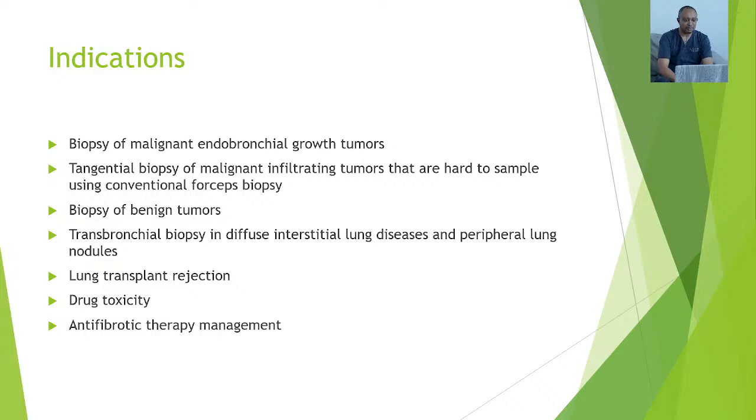When one does the biopsy, this is what we see as we are extracting the tissue. It's completely frozen, and so we'll put it in some saline at room temperature so that it thaws, and then we can submit it for analysis in the lab.